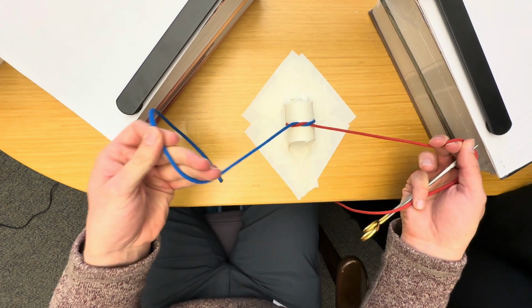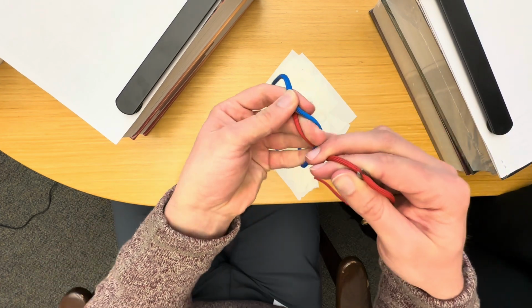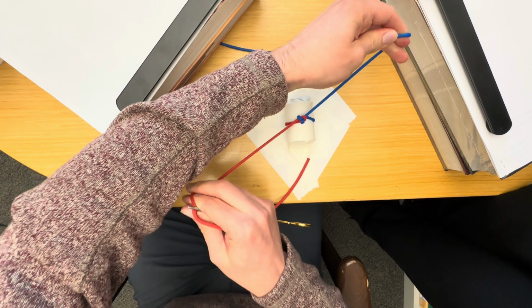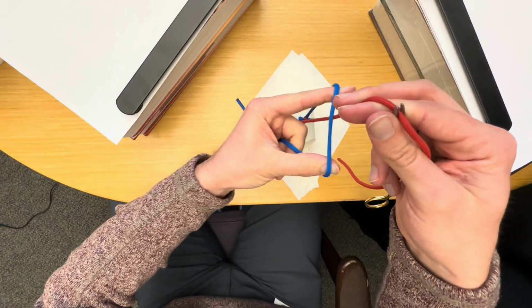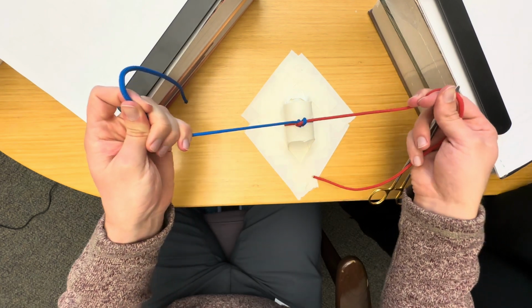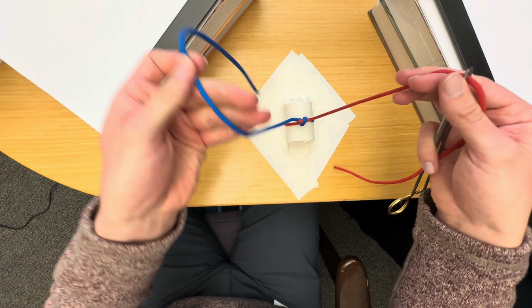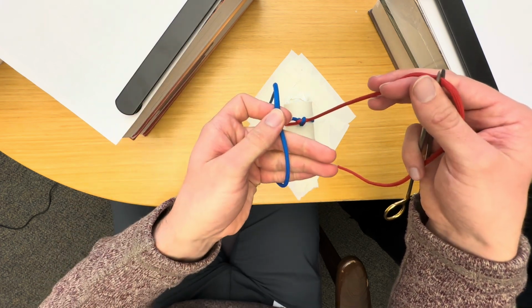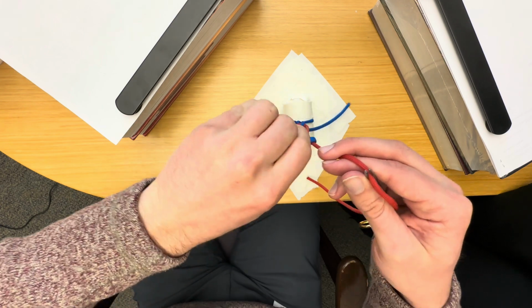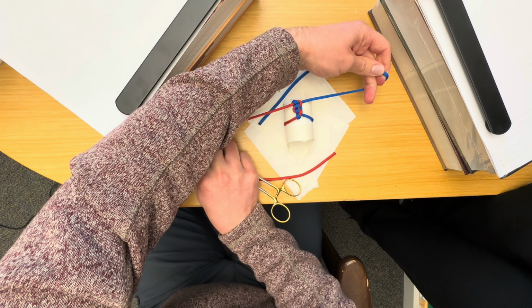Since you grab it like this, you're already in position to do the karate chop. You bring it over your three fingers, grab your middle finger through, pull it straight down like that. You do the C again between the index finger and the thumb, pull it down, get it flat. And then one more time, you do the karate chop. So you have it over your three fingers, bring the needle with the needle driver over, come through with your middle, grab that, rotate, and then you have your knots laying flat like that.